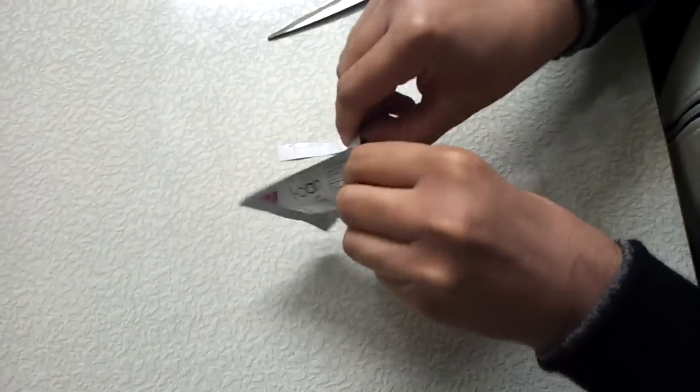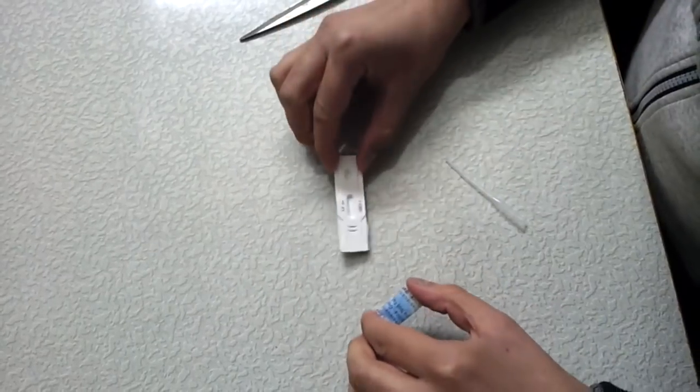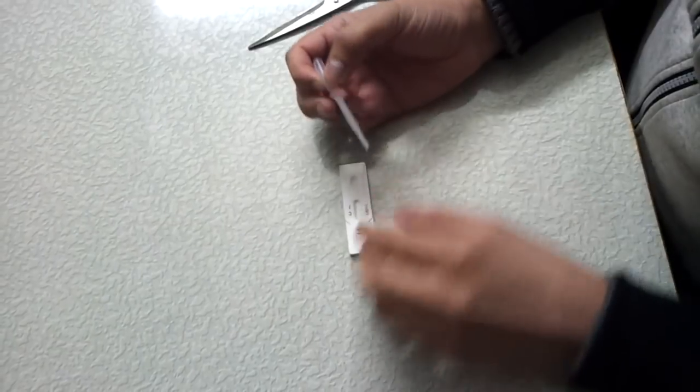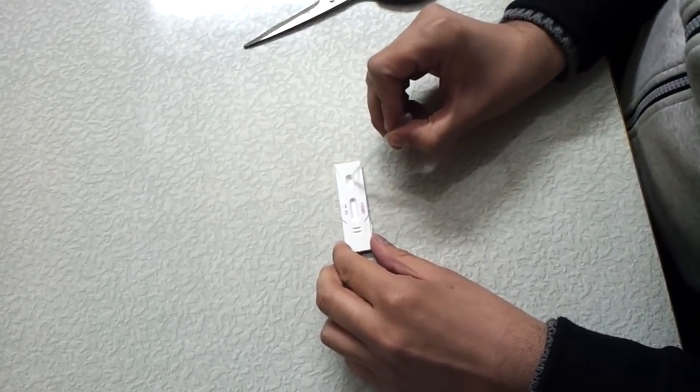Let me open it up. So this is a device and this is a dropper. I will take three drops of urine in this dropper, and I have to put three drops in this circular area.